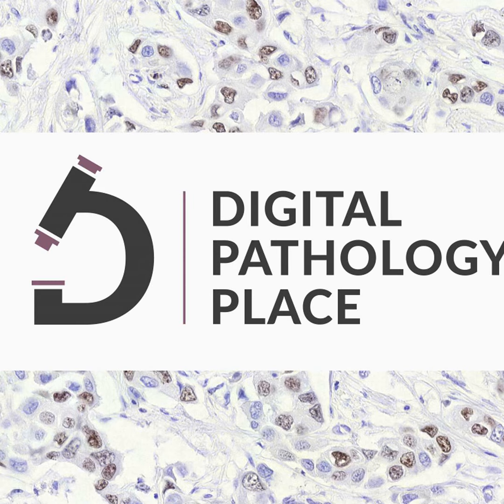Well, if you have quantitative metrics that measure the output of those slides each and every single day, hundreds of times per day, you now essentially can have a quality control process where he can go in and say, I'm willing to accept one standard deviation away from this metric. If 5 slides in a row are produced that are too dark by this metric, I want to receive a page immediately, and I want to shut the lab down to address that problem. And I want to address it after 5 slides instead of at the end of the month after 50,000 slides.